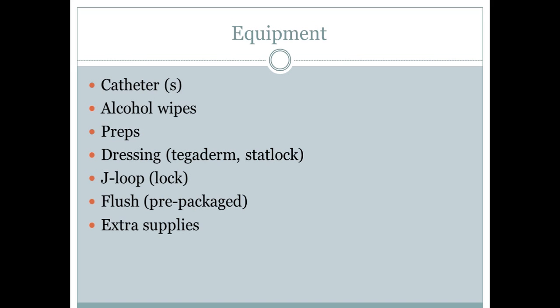You can just grab another catheter that you brought with you so that you don't have to get up and get extra supplies. Some places will have a little caddy, an IV caddy, with extra supplies on it so that you don't have to get a whole bunch and carry it all in. Obviously, alcohol wipes are very good, especially if you have some blood leak outside that site. That's a great way to mop up some blood on the patient.